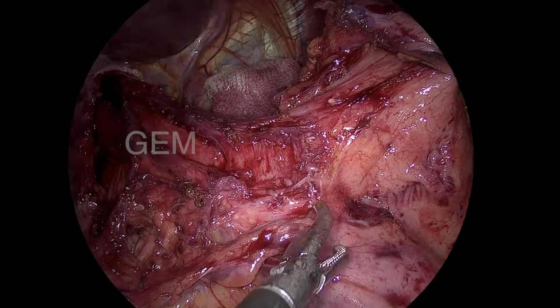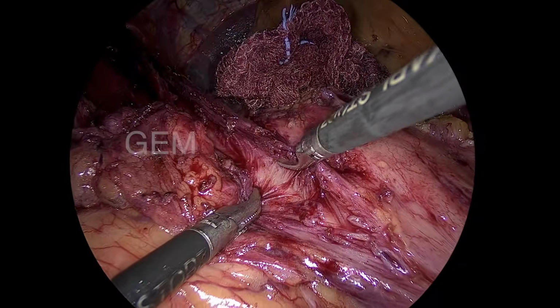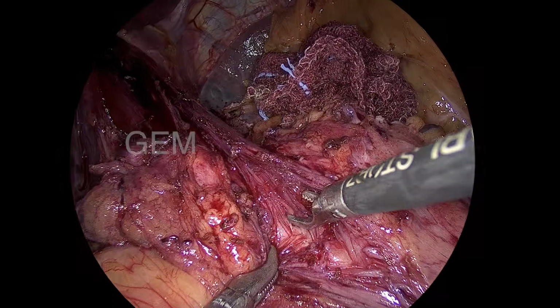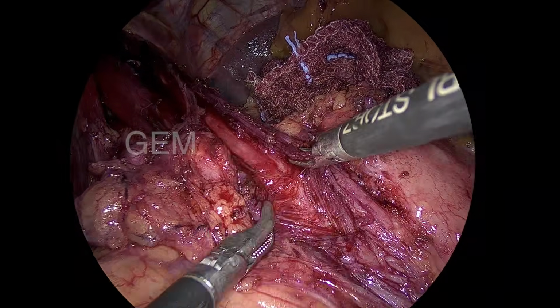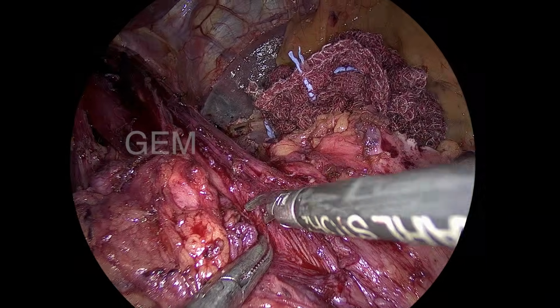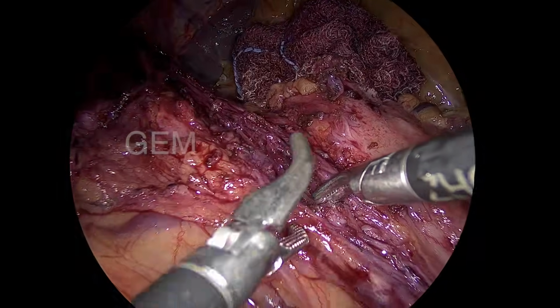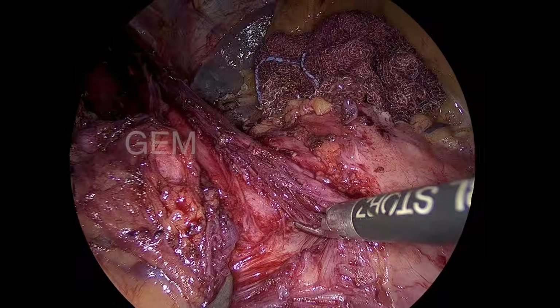Now you can see the length is adequate, but the muscle needs to be separated. These are all very oblique muscle fibers, so you have to separate them carefully. Both-hand Maryland is ideal, so that equal traction can be given. I use very little cautery when separating the longitudinal muscle; otherwise I am not using any cautery. The energy device is not much used, and carefully, under vision, we are separating the fibers. After separation I hold the muscle on both sides and then open it up.